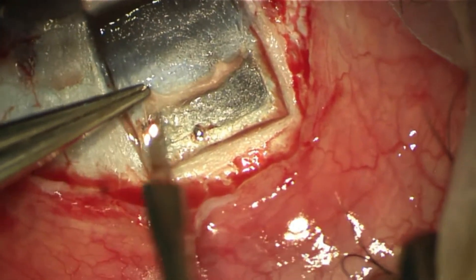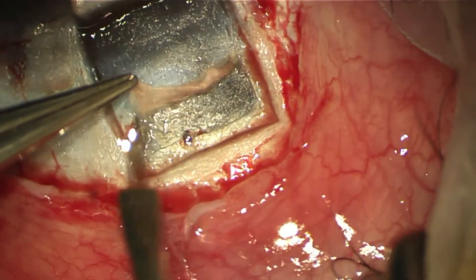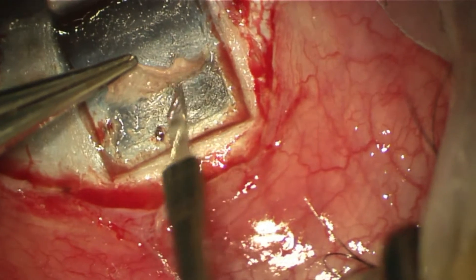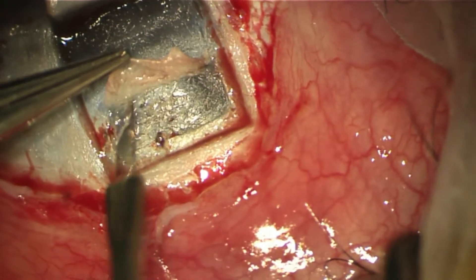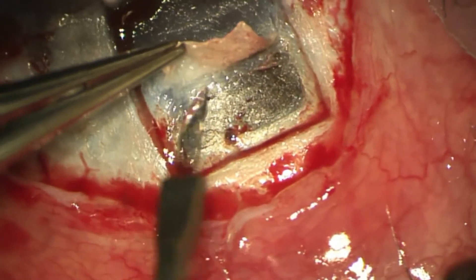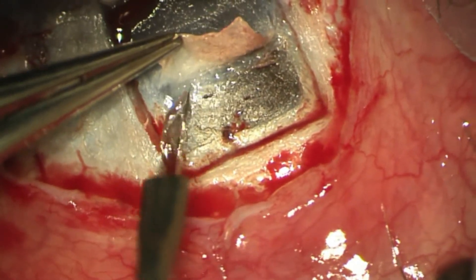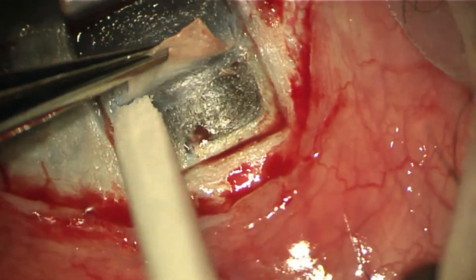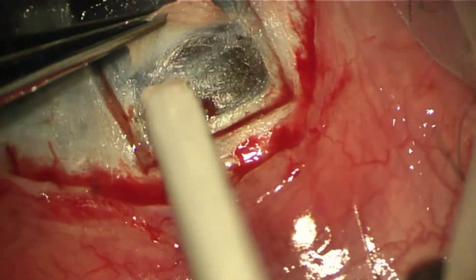It is quite important to maintain the level of dissection all the way towards the area of expected trabecular-Descemet's membrane location. This is important for future filtration.